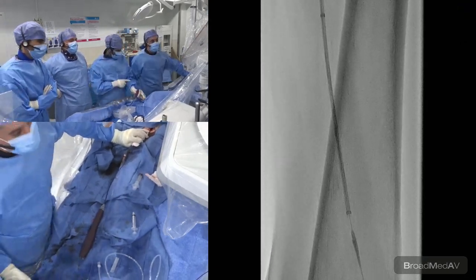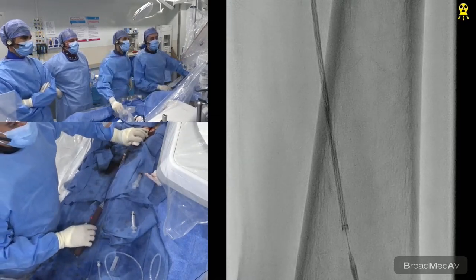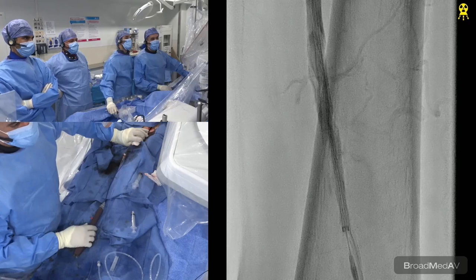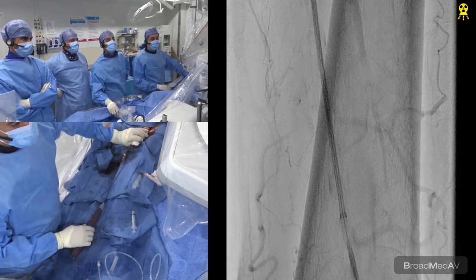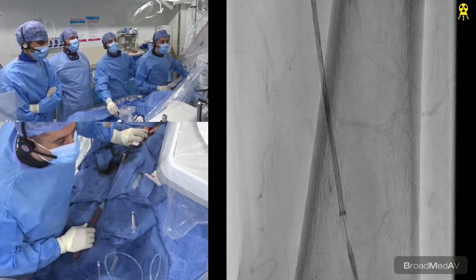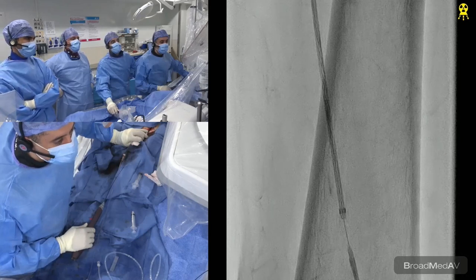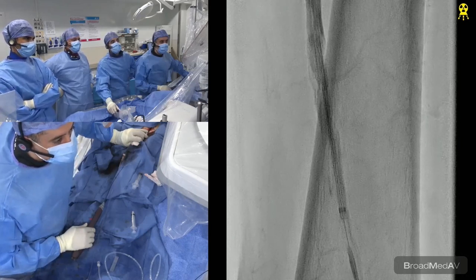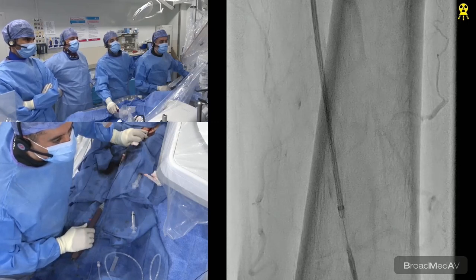When you do these large Superas, you need to zoom up high, and now Robin's going to give a little bit of dye. The dye is going to tell you exactly where that dissection is. You can see the dissection is actually further back, so he's going to pull back a little bit right there. And you're going to have to sometimes allow a little bit of elongation to occur prior distally. So as it starts to flower, he'll pull it back.